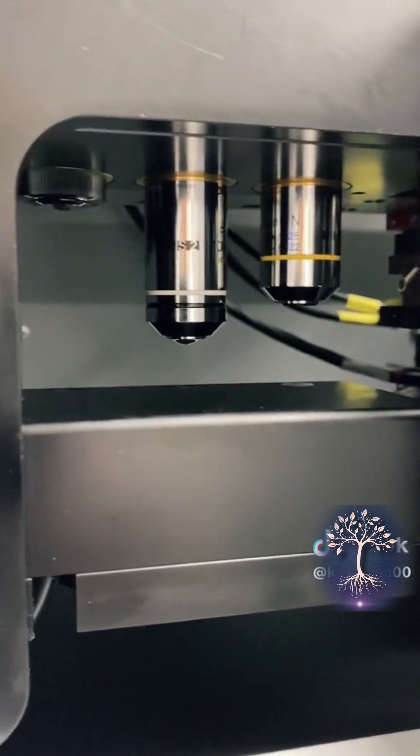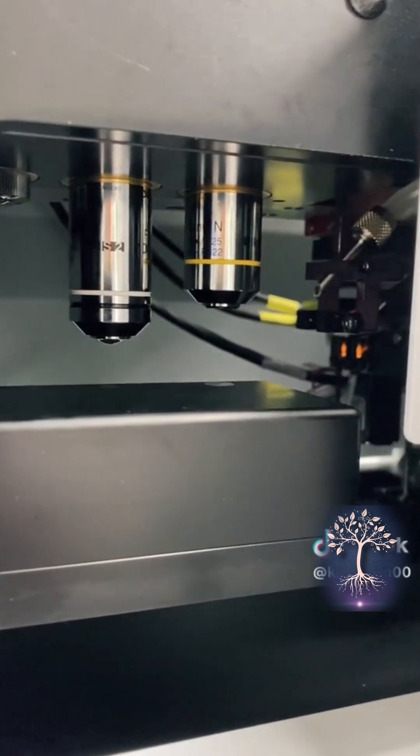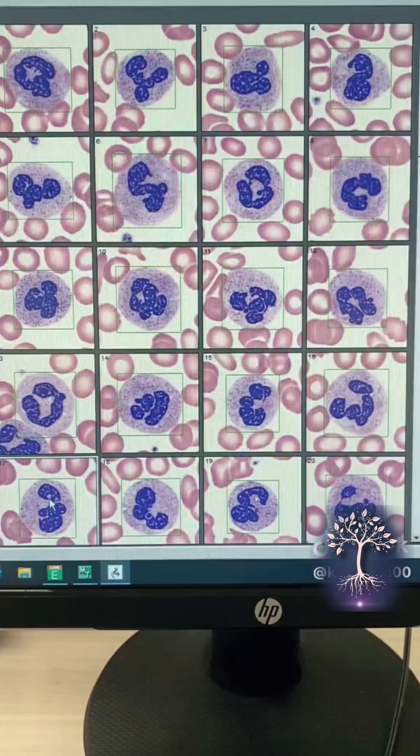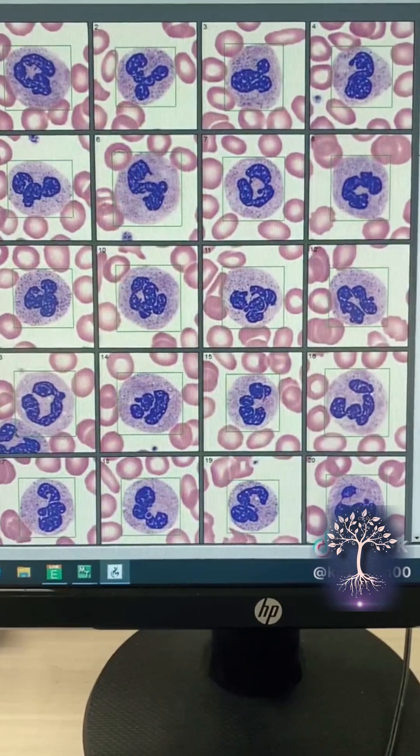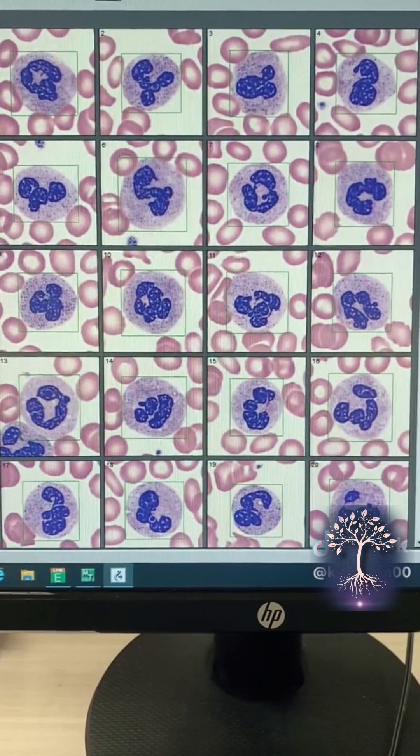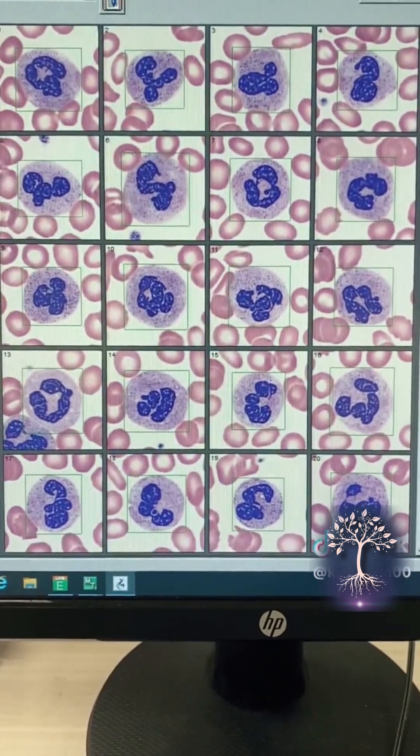Once it reads the slide, it counts 100 cells and then transmits them to our computer system known as the CellaVision, which is what I'm showing you guys here.